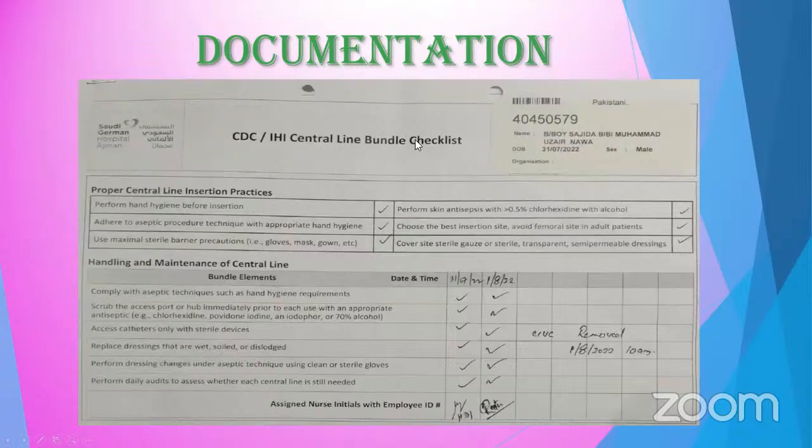Then this is the central line bundle checklist, for proper central line insertion practices. Perform hand hygiene before insertion, yes. Adhere to aseptic technique with appropriate hand hygiene, yes. Use maximally sterile barrier precautions, for example glove and mask, yes. Perform skin antisepsis, we are using an alcohol swab only. Choose the best insertion site and avoid the femoral site. These are central lines in general, not specific to umbilical, this is our checklist, so that's why it tells you to avoid it. And then comply with the aseptic technique.